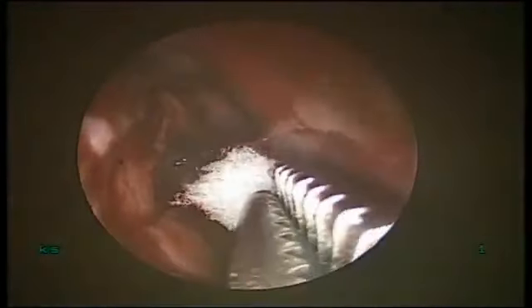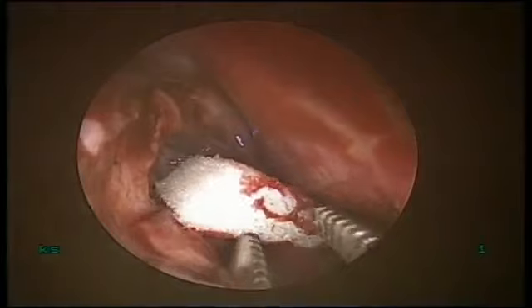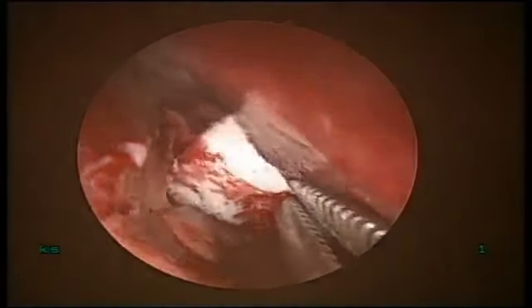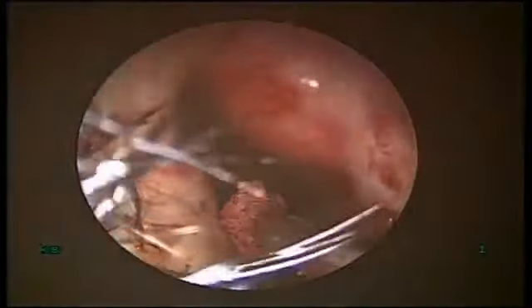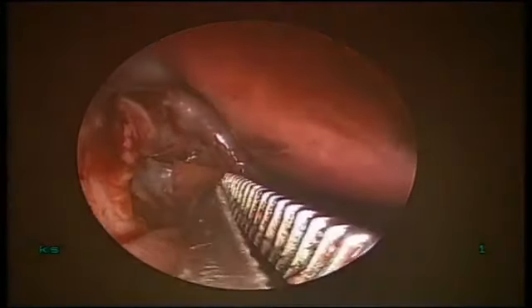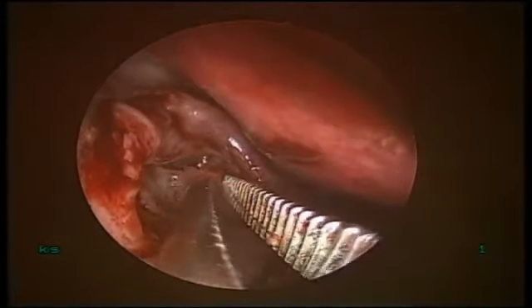See this one piece of gel foam where I am using. I will remove it back. This one piece of gel foam I am using to stabilize my posterior flap.